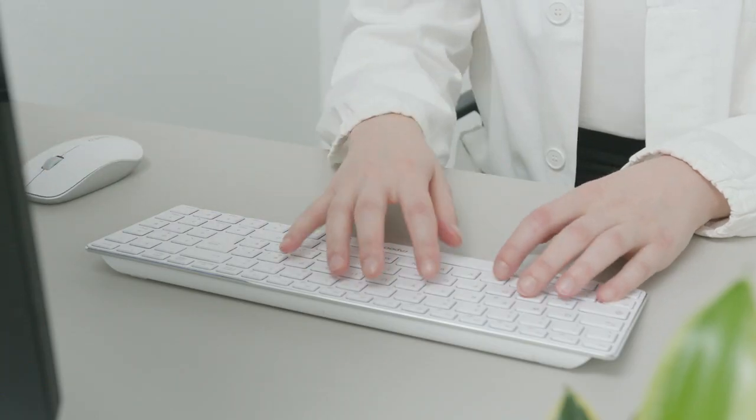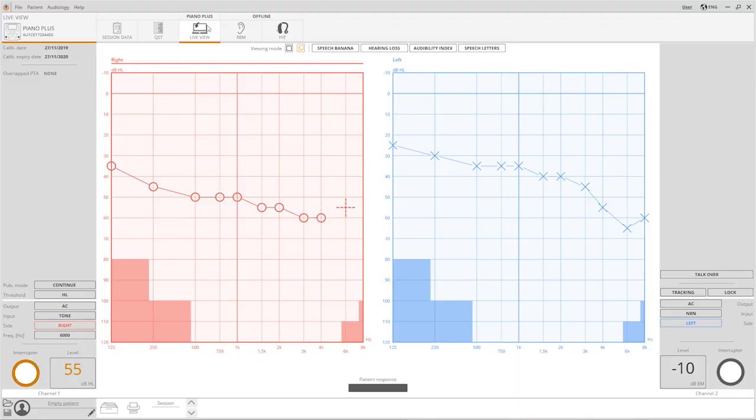You can decide whether to operate the Piano in its traditional standalone mode or to control it through the computer. With the Live View feature, you can have a wider view of the examination that's in progress on the computer display.